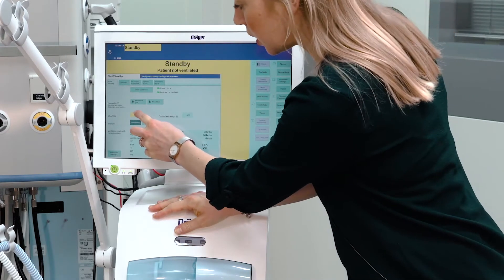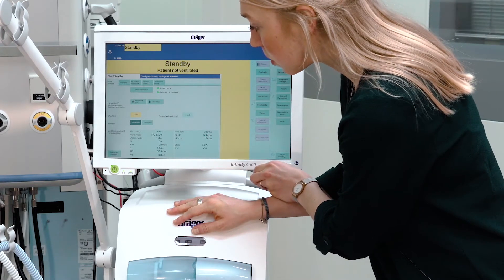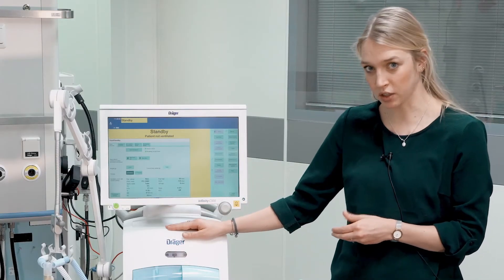If configured, you can individually set the current body weight of your patient, which will in turn adapt the respective ventilation settings to the body weight.